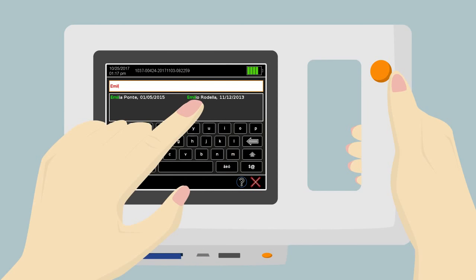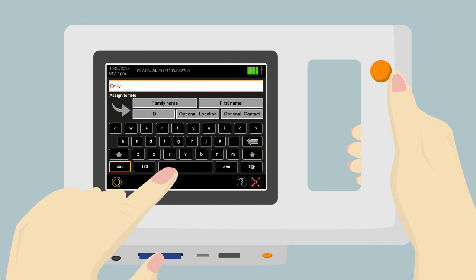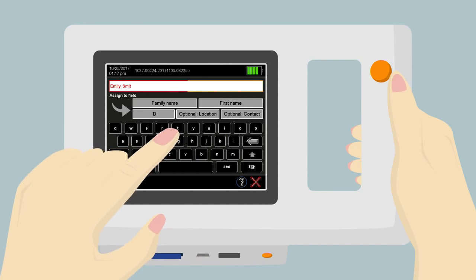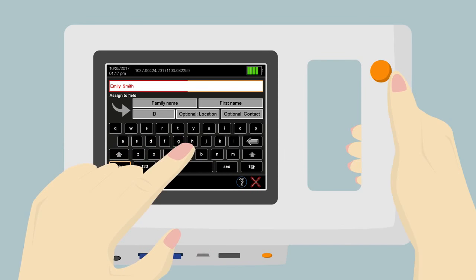the right patient. If you want to create a new entry, you need to type in more patient data until there are no other entries with the same letter string left. This is necessary to be able to uniquely identify a patient in the patient database.